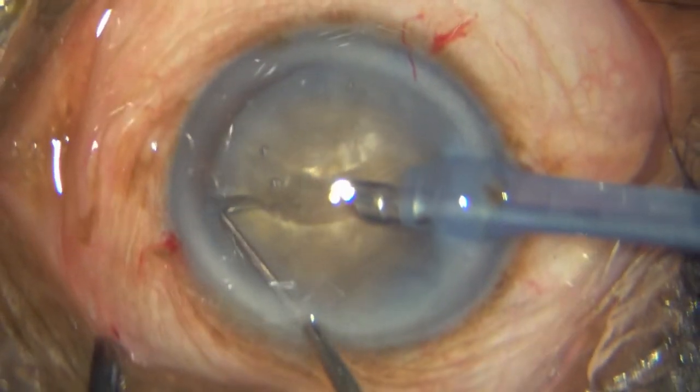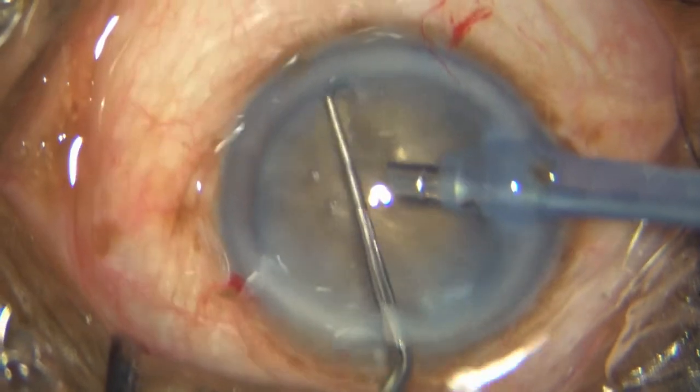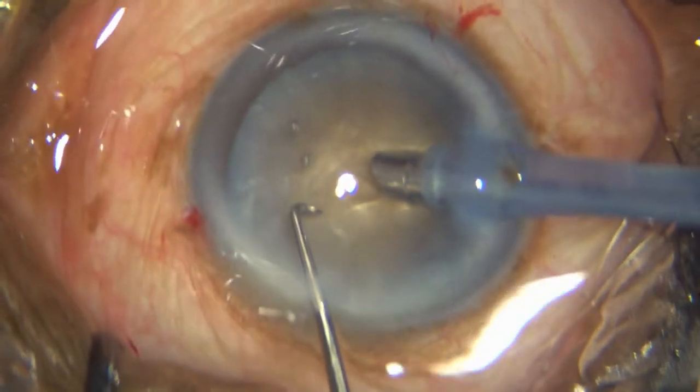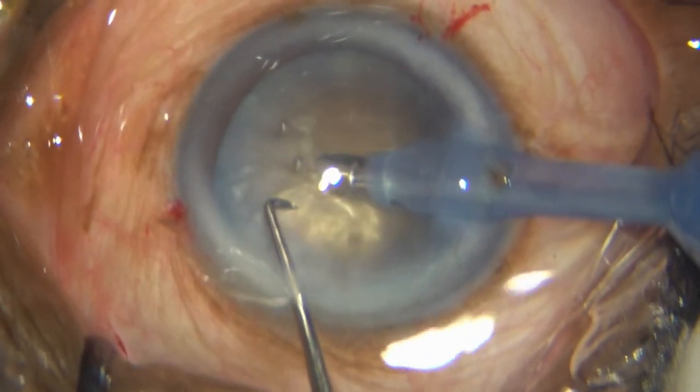I don't mind if there are a few cortical fibers, a few lens fibers in the center, because I don't want this to separate as yet. The idea is I do not want free-floating pieces at this point in time.